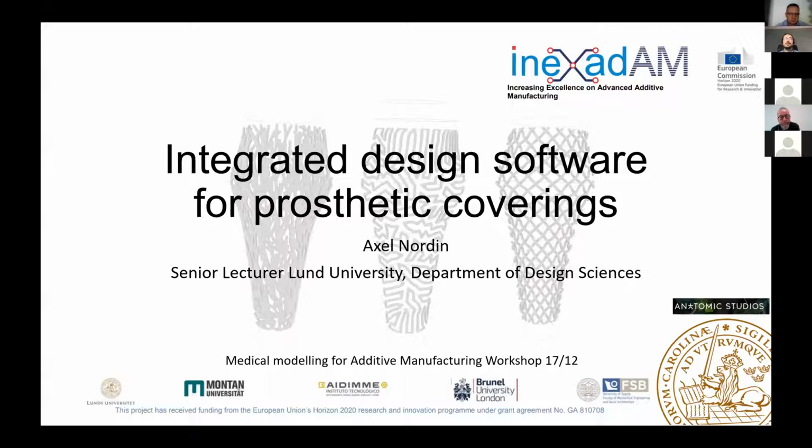I'll be talking about a process, a software that we have developed as part of a research project for a company based in Malmö in Sweden that deals mainly with prosthetic coverings for leg prosthetics. I'll bring you through that in the next 30 minutes or so.